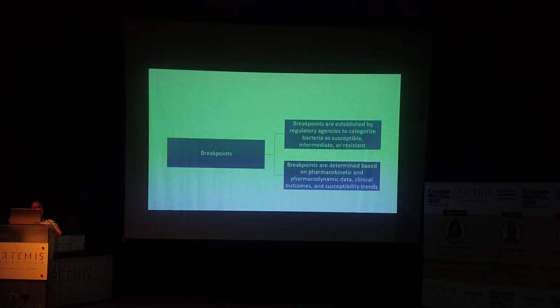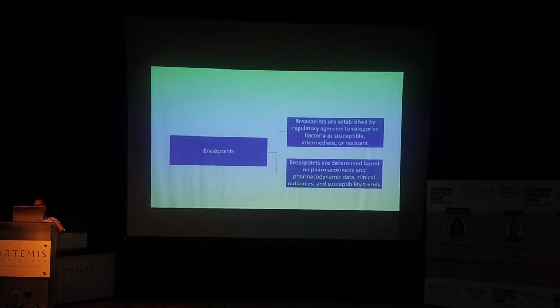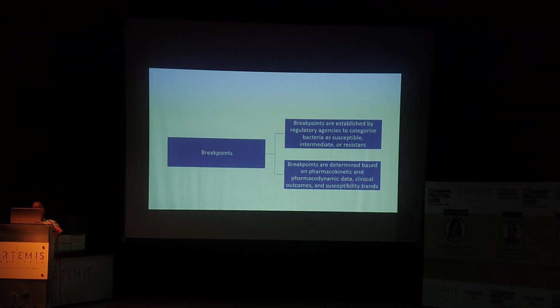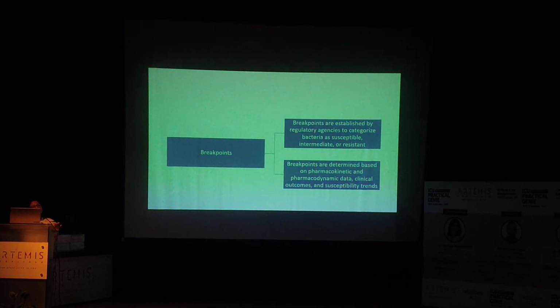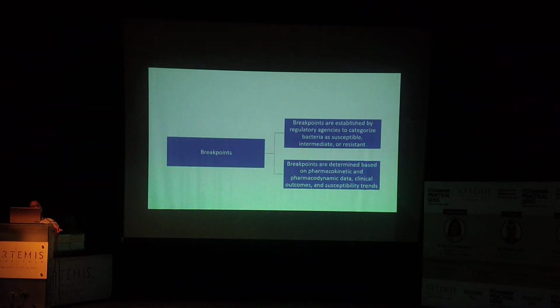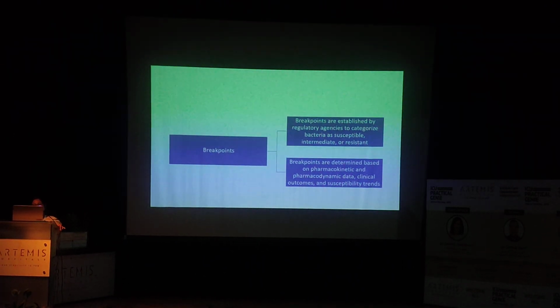Breakpoint is established by regulatory agencies to categorize bacteria as susceptible, intermediate, or resistant. That means this is a particular concentration of antibiotic, which is determined by those agencies on the basis of pharmacokinetic and pharmacodynamic properties of the drugs and how much concentration that achieves in the blood.